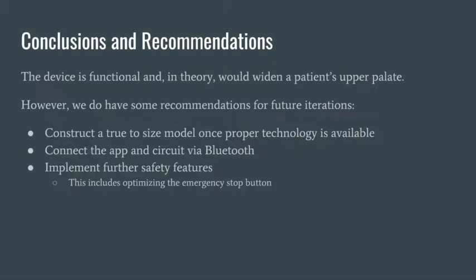And then also we would like to implement further safety features. While we do have some, you can never be too safe. And so this would include optimizing the emergency stop button that was previously mentioned. We want to make sure that it's in a location that the patient won't accidentally set it off, but that they can easily reach if it was needed, and also making sure that the device stops completely until they can see their orthodontist.